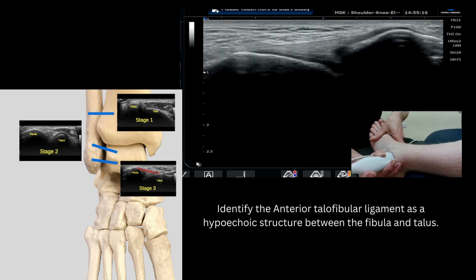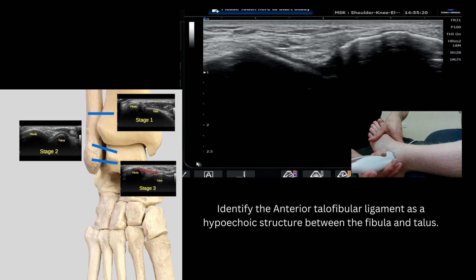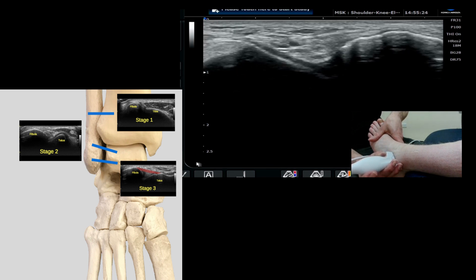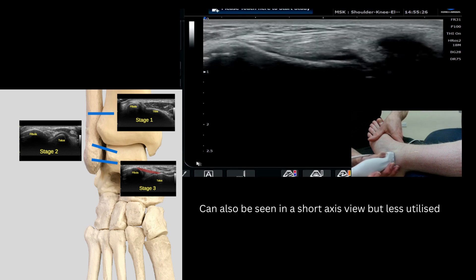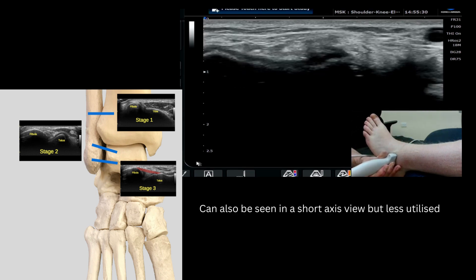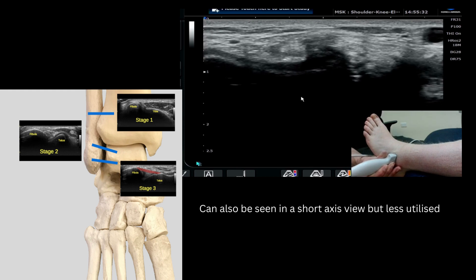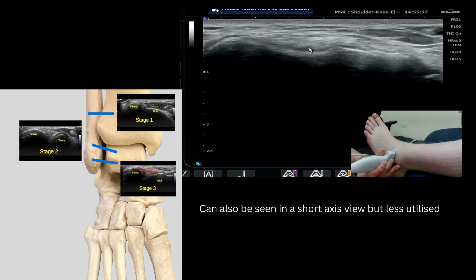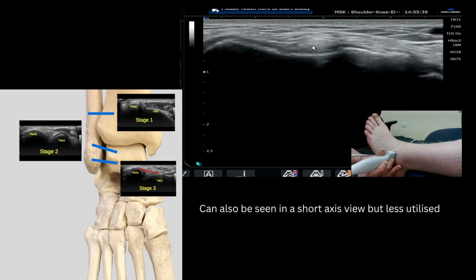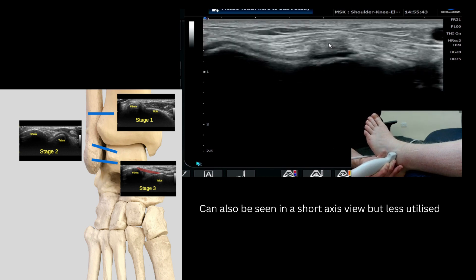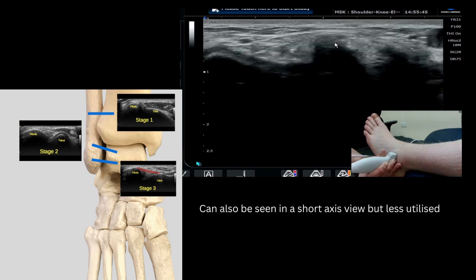You can also look at this ligament in a different view, which is a short axis view. It doesn't tend to get utilized so much in clinical practice, but it can be a useful go-to if you're looking at a ligament and struggling to work out if there is a full thickness tear. Moving to a short axis view confidently can enable you to have a little bit of extra information to help you plan your final report.